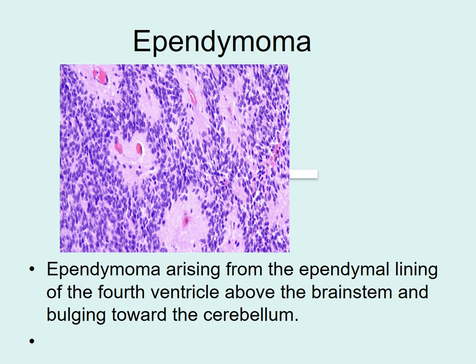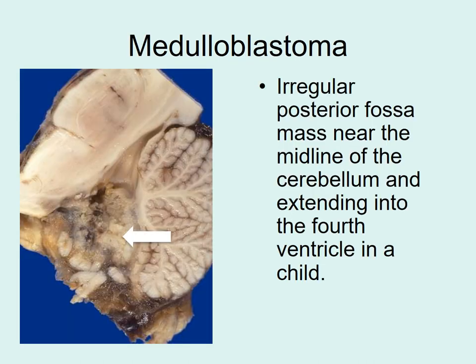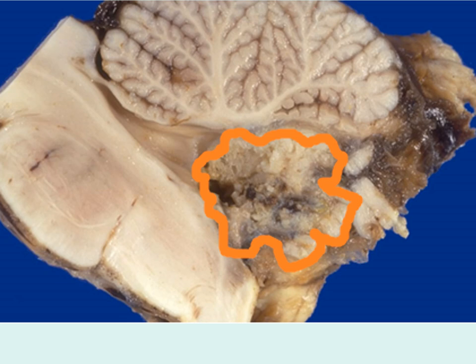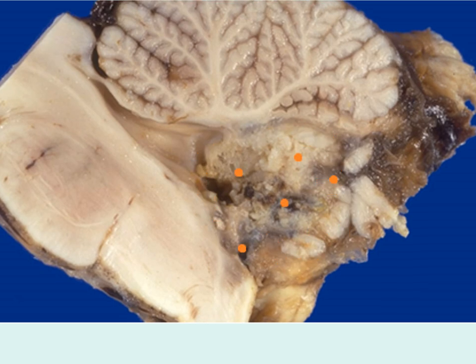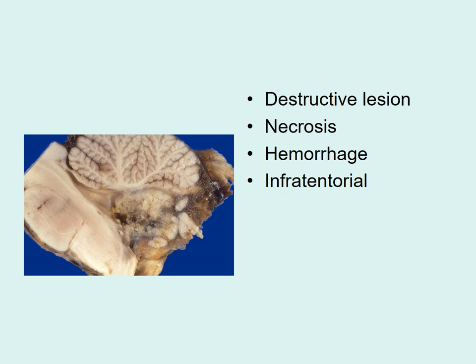Ependymomas arise from the ependymal lining of the fourth ventricle above the brain stem, bulging toward the cerebellum. Next is medulloblastoma — a malignant tumor arising in the posterior fossa, usually infratentorial, occurring in children. Closely examining the gross specimen, it has infiltrating margins and different shades indicating necrosis and hemorrhage. The cut surface is heterogeneous with an irregular outline, making it a destructive lesion showing necrosis and hemorrhage.